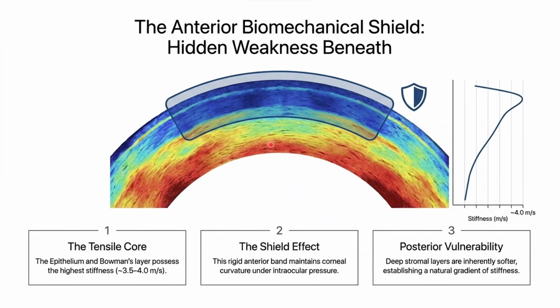That's the principle of measuring the corneal biomechanical property by the Corvis ST. However, OCT elastography is something different, because we measure the speed of propagation of the shear wave inside the tissue, and by mathematical calculation we can estimate the shear modulus and then determine the stiffness of the structure.